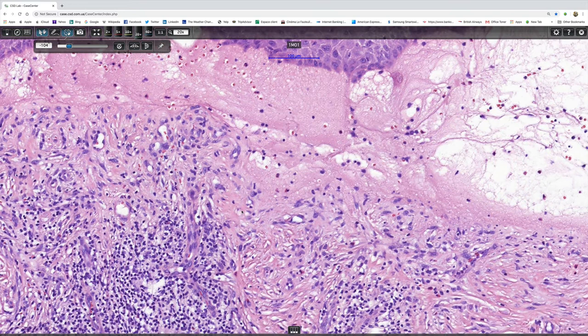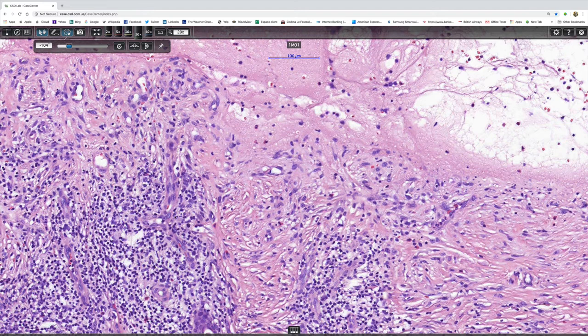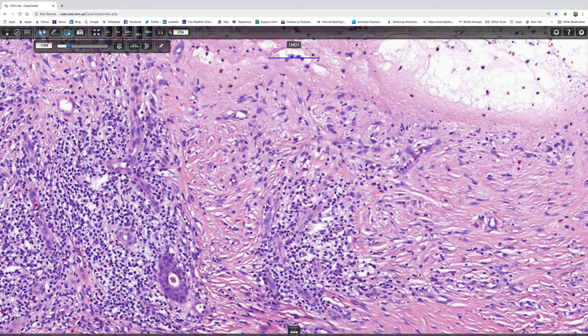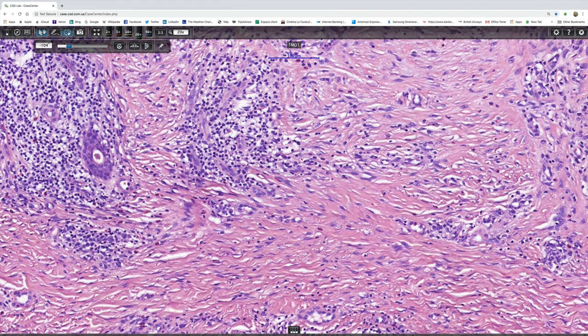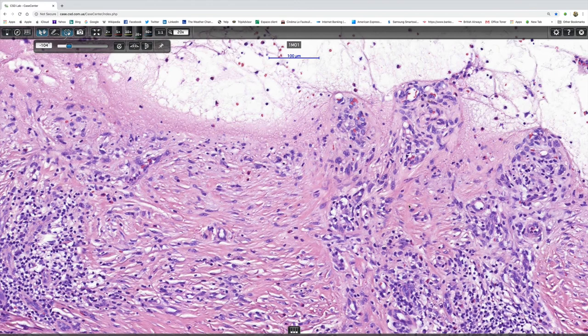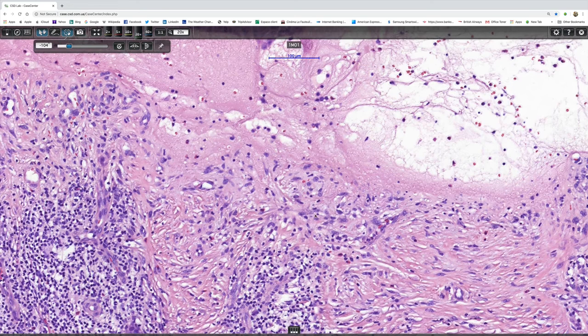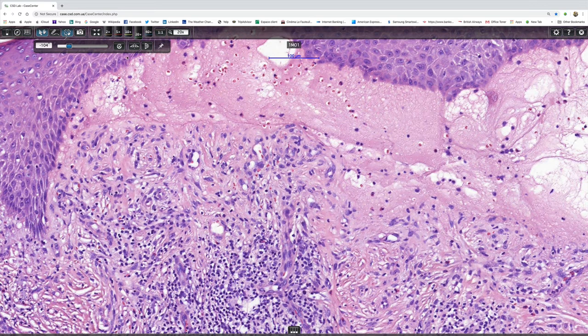I did mention the porphyrias and pseudoporphyria. Looking at the vessels, you can see them very nicely, and there's no evidence of basement membrane reduplication or thickening, which you'd expect to see in those latter two conditions — so I think we can rule those out. By virtue of the basement membrane's localization, we can also rule out epidermolysis bullosa acquisita.